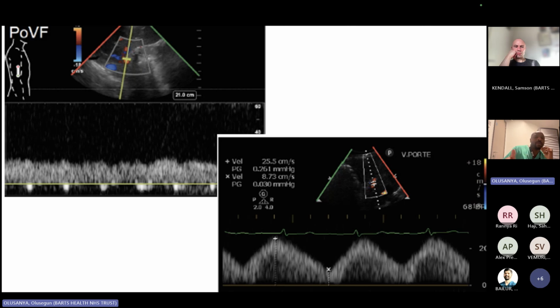So this is before I get to that. This is the stuff that's from William Beaubien-Souligny's last paper. So this is portal venous flow. This is what your normal portal vein should look like on the top left. It should normally be a nice continuous hum. And then as you start to get this congestive phenotype, your portal vein starts to become pulsatile, and it starts to look like this. When you get severe portal pulsatility, you can actually get a reversal of portal venous flow.